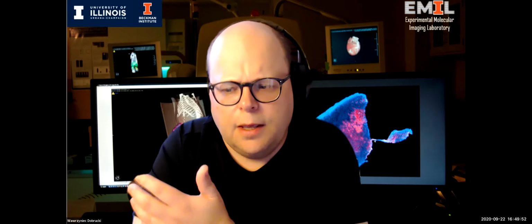So if you are interested in imaging, let's say, vessels, or tumors, but most contrast agents are used for vessel imaging, you want to increase the contrast on the image by increasing the attenuation. So more X-rays will be attenuated, resulting in a brighter image on the CT screen. Okay, that makes sense.